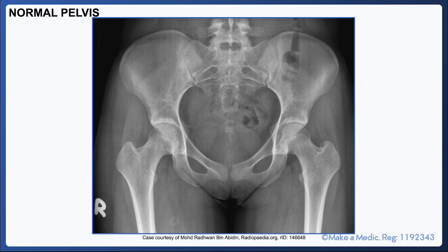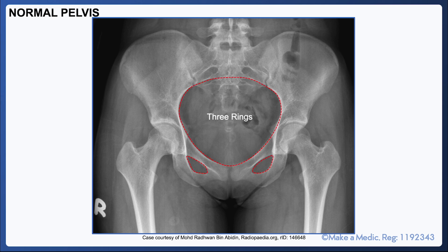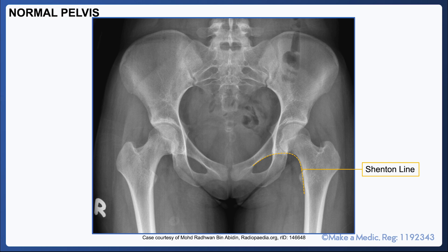Generally, if a hip fracture is suspected, the patient should have an x-ray of their pelvis as well as the affected hip. With a good pelvis x-ray, you should be able to see from above the iliac crests to about one-third of the way along the femoral shaft. You should also be able to trace the three rings, which are the main pelvic ring and the two obturator rings. They should all be smooth and any irregularities may be suggestive of a pelvic fracture. Then you should turn your attention to the hips and trace Shenton's lines.